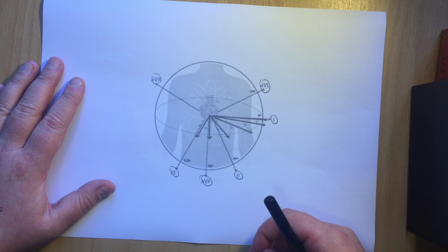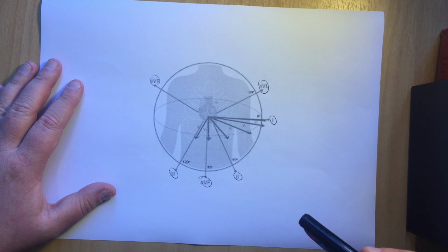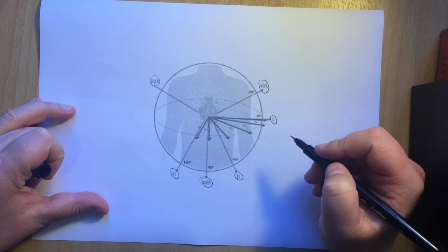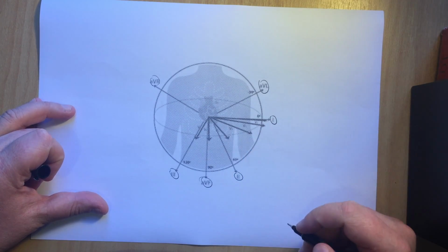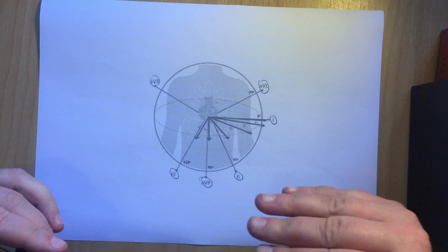We've then got what we call the chest leads, and the chest leads are looking at the heart in a horizontal plane. So they are our V leads. They haven't printed out especially well here, but they go all the way around there, from V1 to V6, and that's looking at the heart from different angles in a horizontal plane.